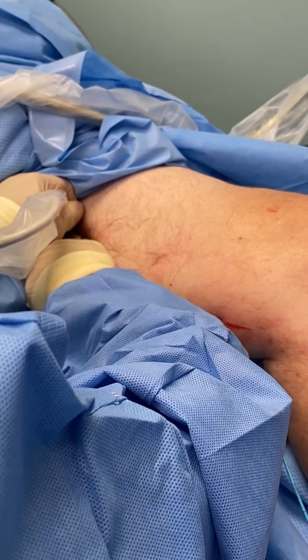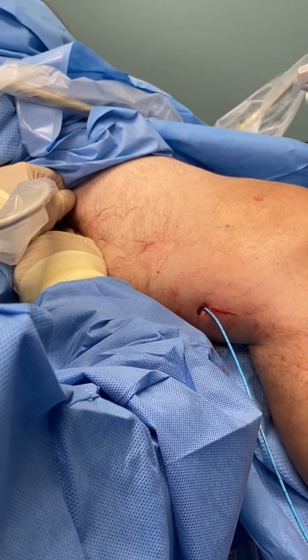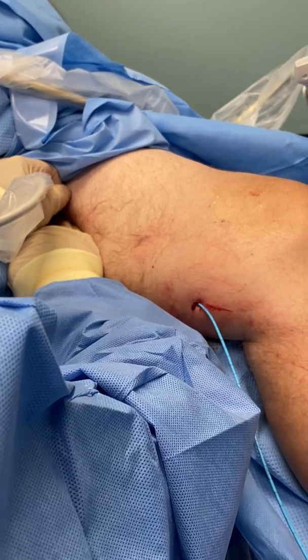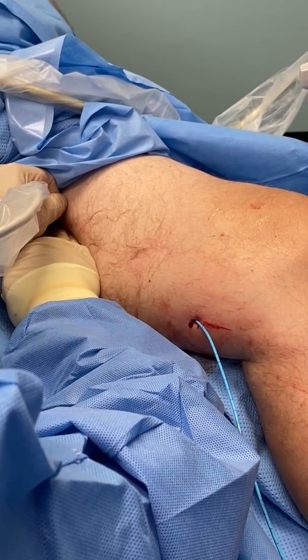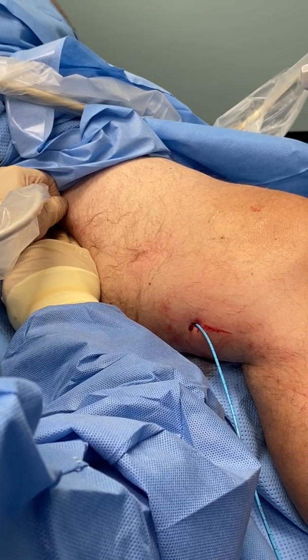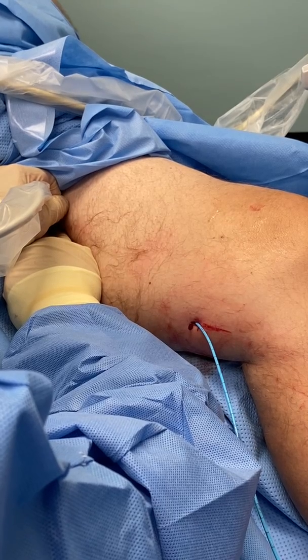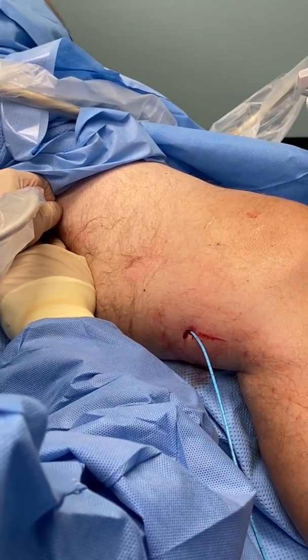This aliquot — and this will probably be the longest three minutes of the procedure. What happens is this glue is activated by the platelets which line the inside lining of the vein wall, and the glue will then adhere to the walls of the vein and close it. So it's a medical adhesive; the name of the procedure is called VenaSeal.